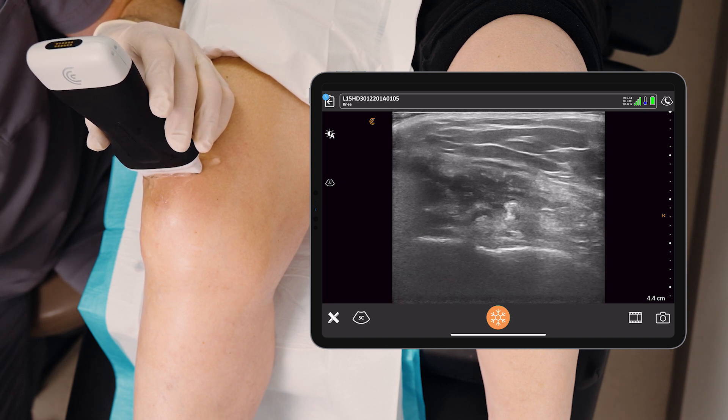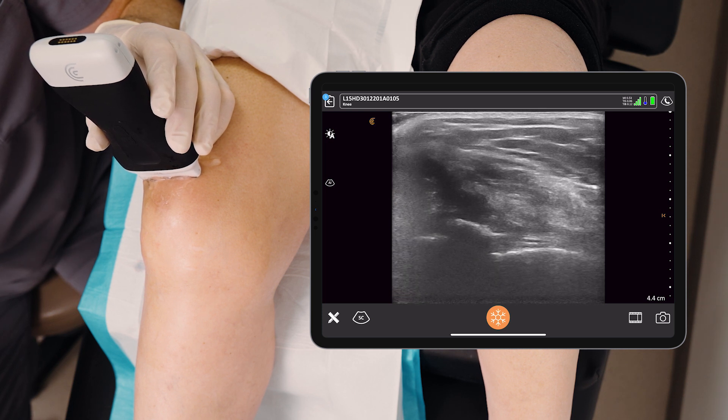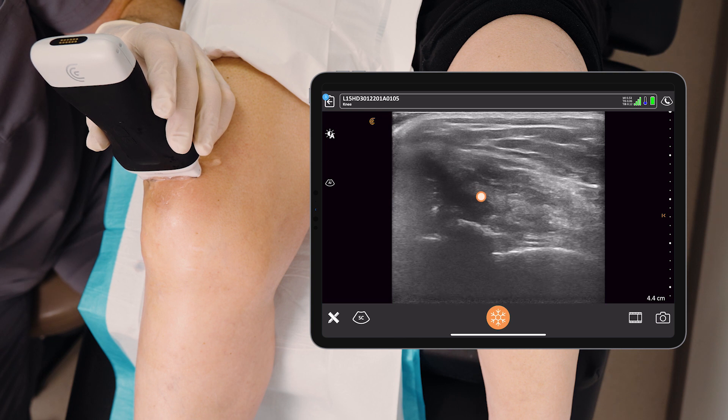If I make a slight movement of my probe distally towards the knee, we do see all of a sudden a black area on the screen pop out. That's the fluid — that's my target.